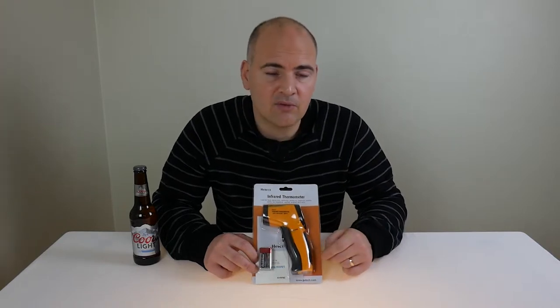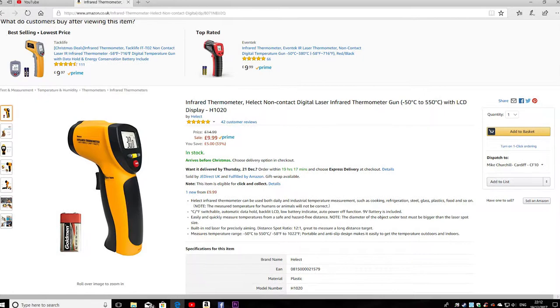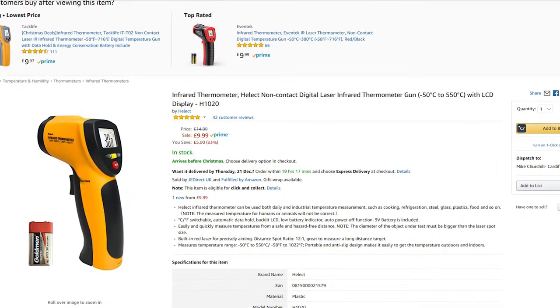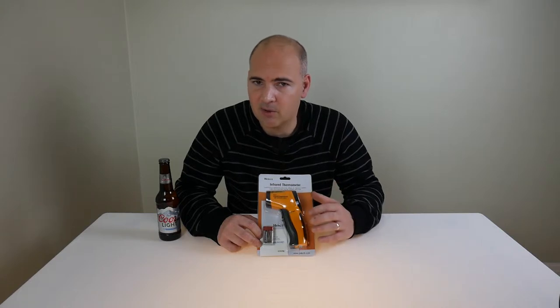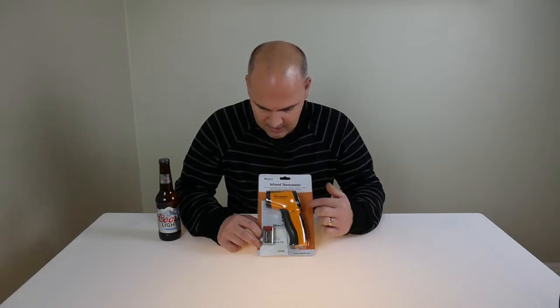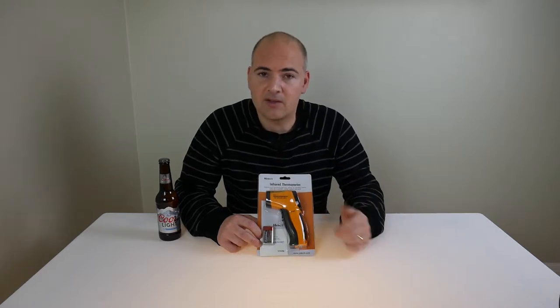Speaking of money, this is currently retailing on Amazon for about £10. It fluctuates price-wise from about £10 to £15 on this particular model. There are other very similar ones, and I would imagine they're all of a very similar nature, but this particular one — the Helect one — is the one I'm going to review.